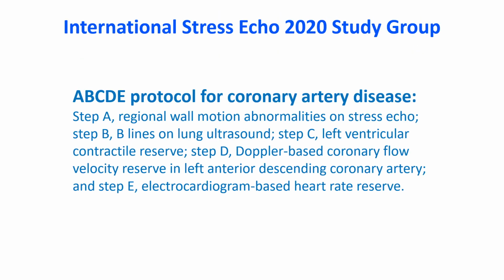The International Stress Echo 2020 study evaluated the prognostic value of left ventricular contractile reserve both in ischemic and non-ischemic heart disease. The study used the ABCDE protocol for coronary artery disease. Step A, regional wall motion abnormalities on stress echo. Step B, B lines on lung ultrasound. Step C, left ventricular contractile reserve.